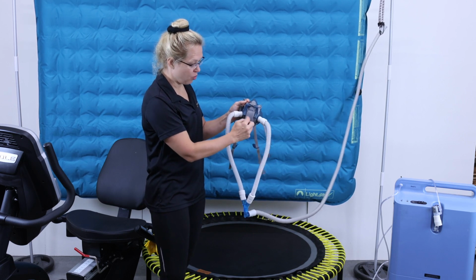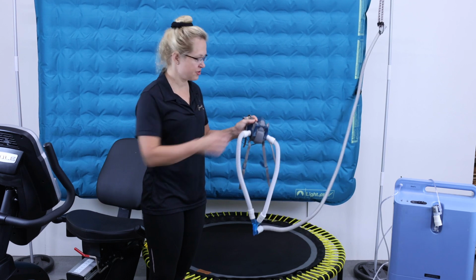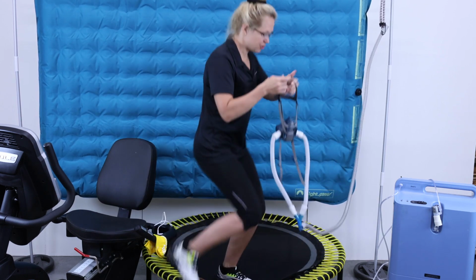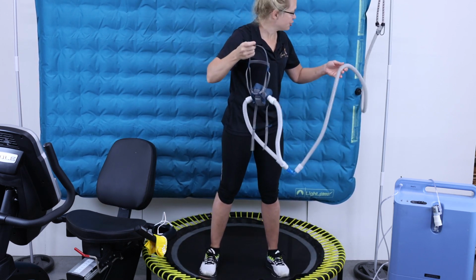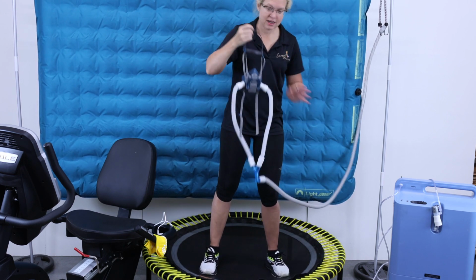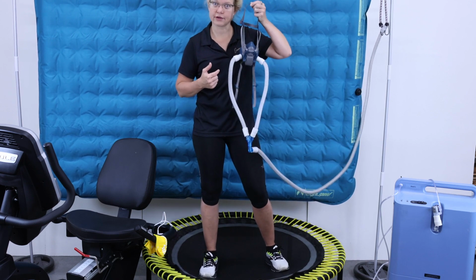But a lot of them have one hose right in the middle. That works too. One hose is fine. You don't need two hoses for a lot of people. Now, for rebounding, if I decide to rebound, the hose goes up and down, and so you'll have to have a bungee cord or something to hold it so it doesn't get in your way. So that's the disadvantage of using a rebounder when you do your exercise.